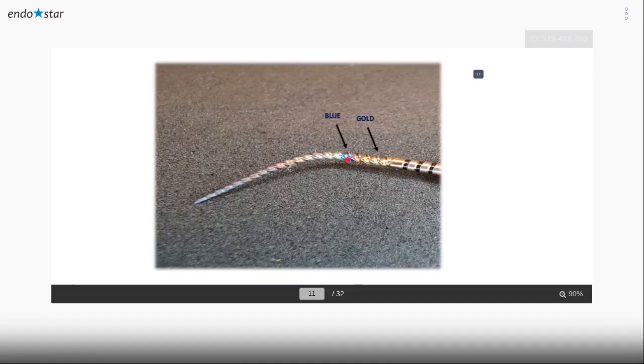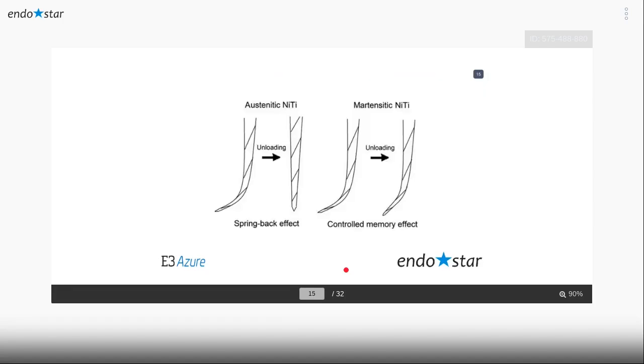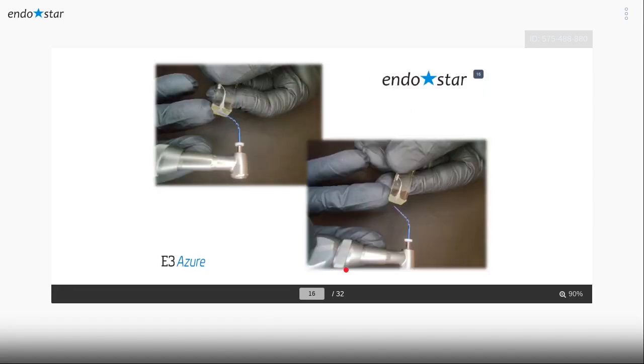Only a change in temperature or cooling process during production can give a tremendous change in the mechanical properties, not only regarding the design and the taper. Changing the temperature by a small difference gives new generations of files, which are available in the market, as we will discuss right now.